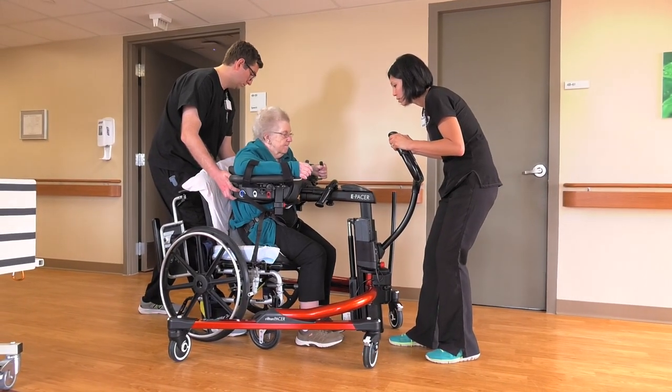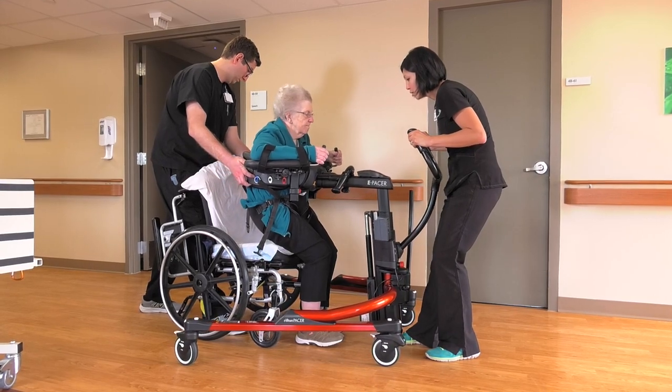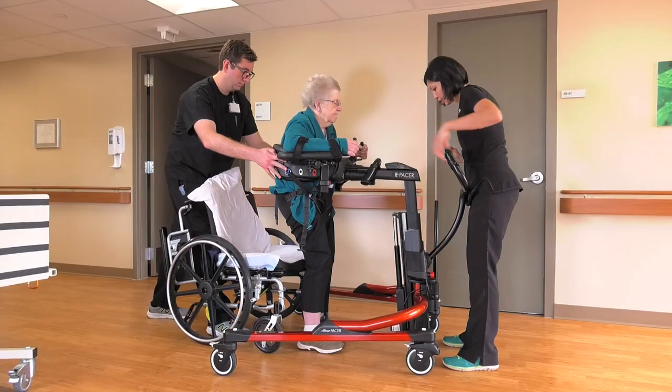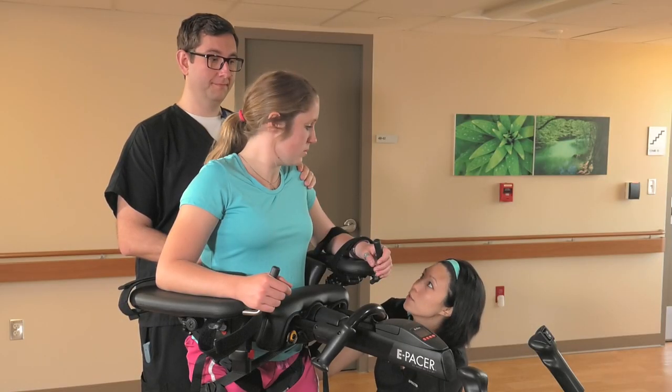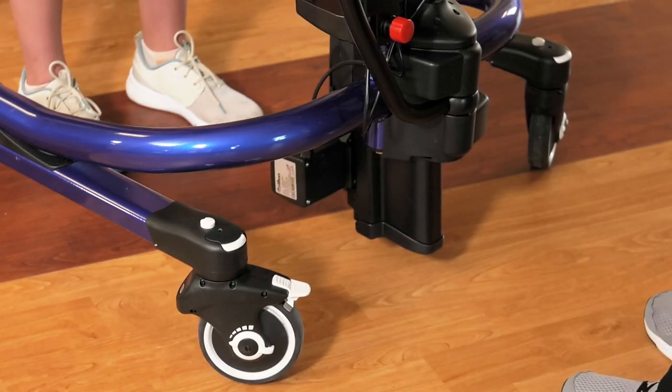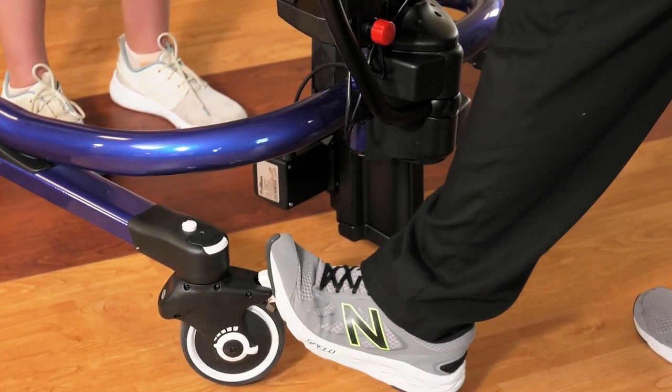An assistant should steady the patient and adjust straps as necessary, since the fit may change as the patient rises to a standing position. When the patient is standing, the top of the armrest should line up with her lower ribs. Once the patient is standing, lock the front brakes.